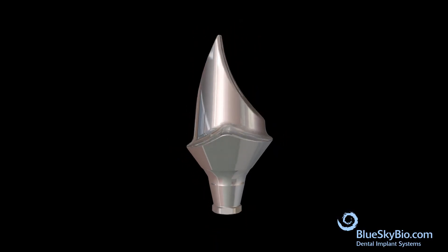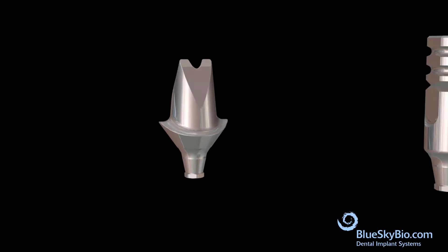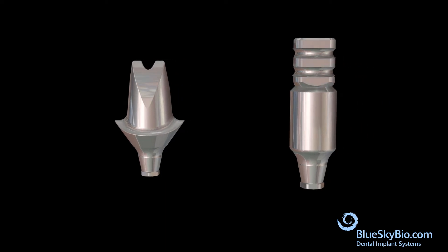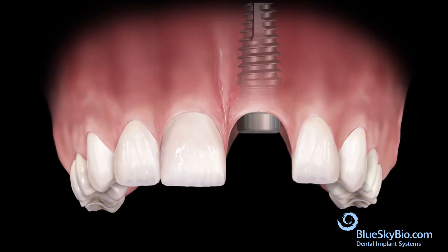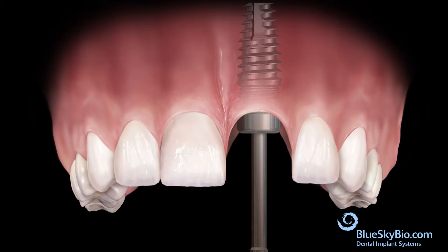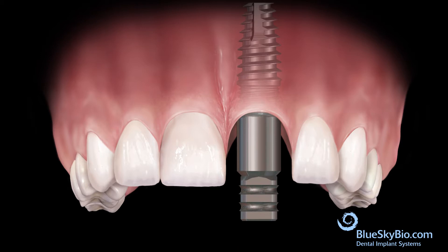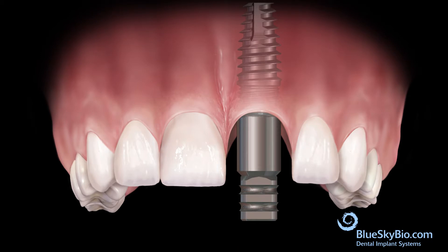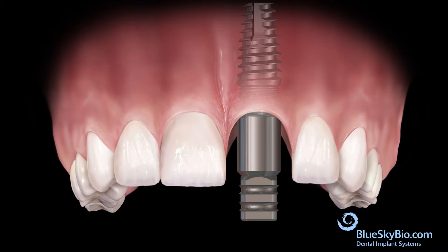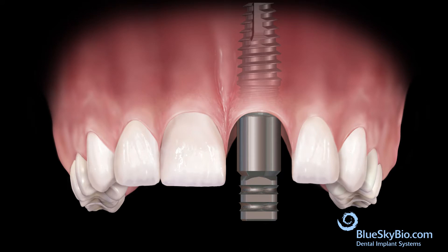This video shows how to make a custom abutment from a multi-purpose abutment for improved aesthetics after the implant is adequately integrated. Remove the healing abutment and insert the multi-purpose abutment. It is important that the mating area of the multi-purpose abutment fully engages the mating area of the implant. Tighten the fixation screw only with finger pressure.